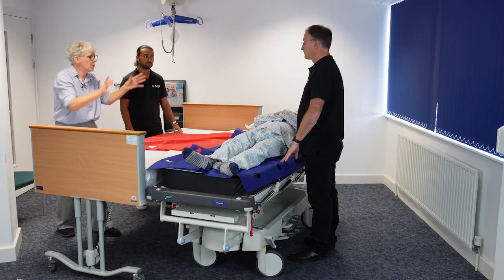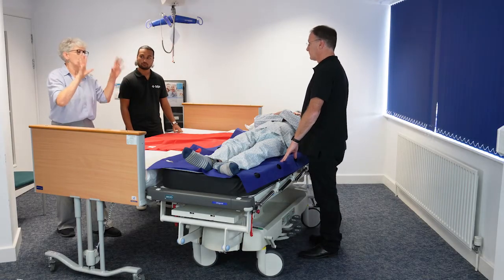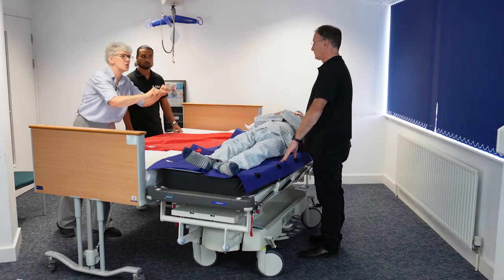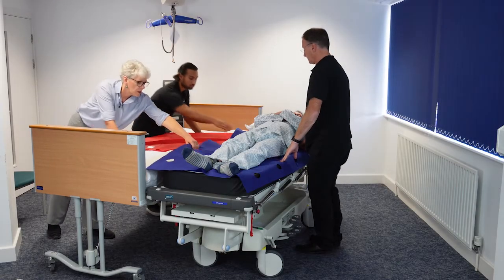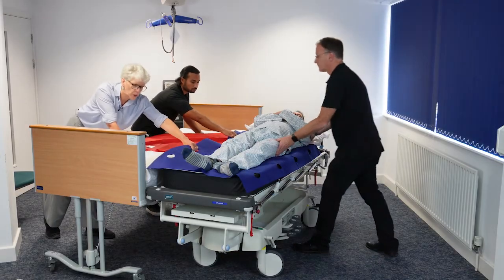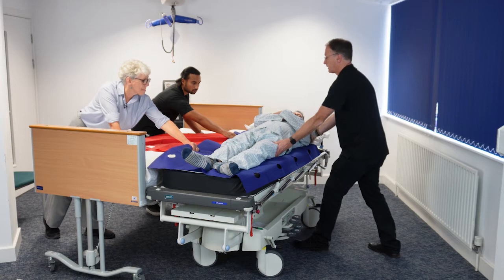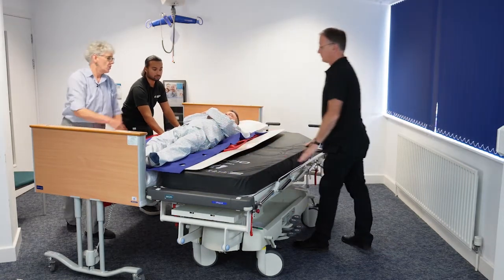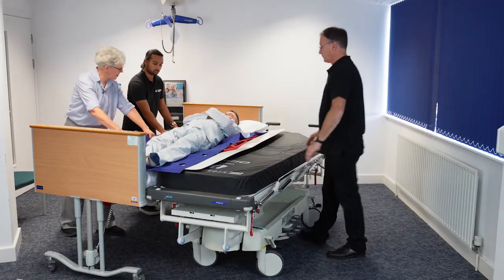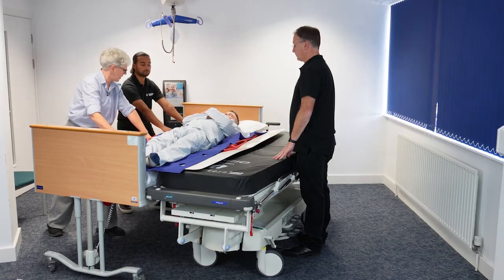You're going to initiate the movement to start bringing Colin across, and then we're going to stop and reposition our hands and then do the final bit. I'm just holding on — not pulling at this stage. Ready, steady, slide. So we stop there. At this stage we take hold of two handles and with a step stance we're going to bring him back this last bit. Ready, steady, slide. Lovely.